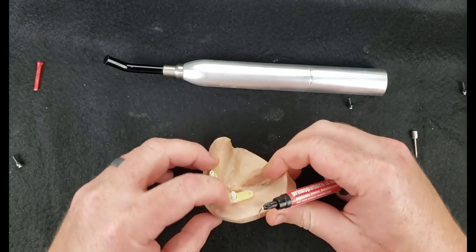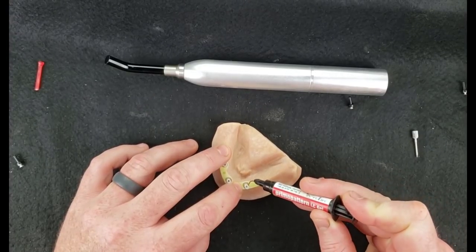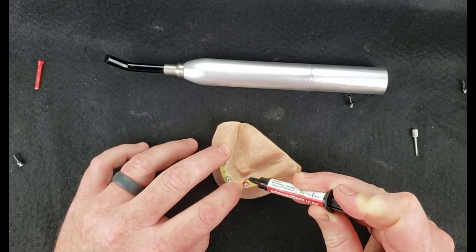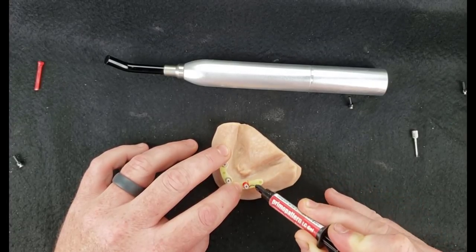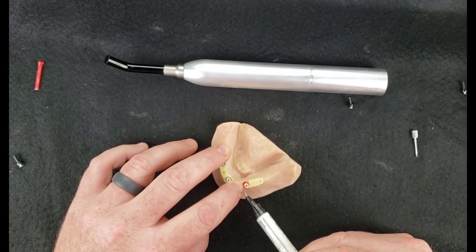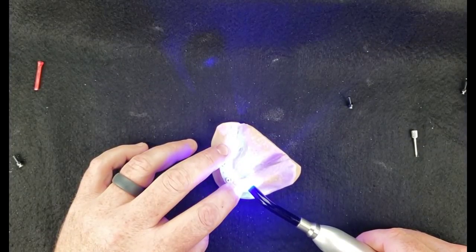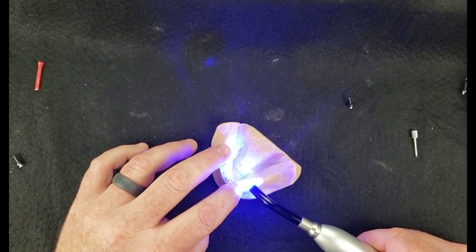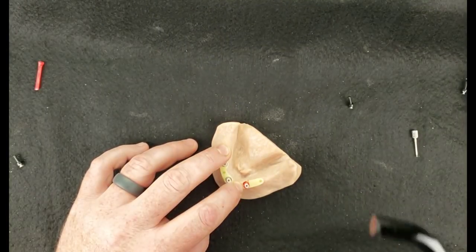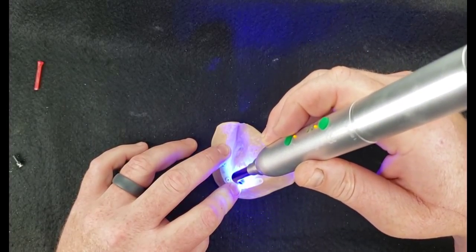So I'm going to make sure that I'm sitting flush everywhere on my model, and I'm going to just place Primo pattern directly in this gap and begin picking this up. Okay, and then we'll light cure that. I forget the exact time you're supposed to cure this, but I always do just short cure times initially, and then when I'm all done, I will give it its final cure and make sure everything is really, really hard.